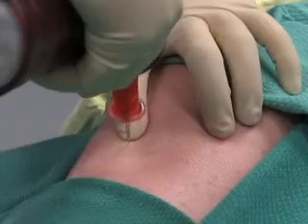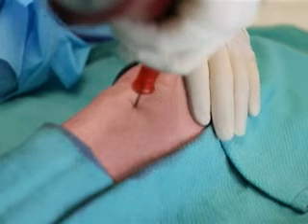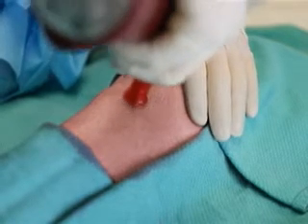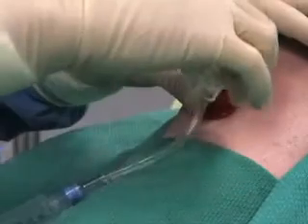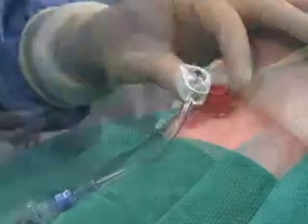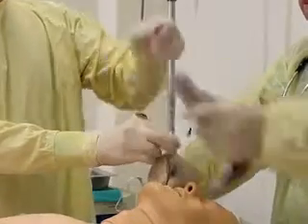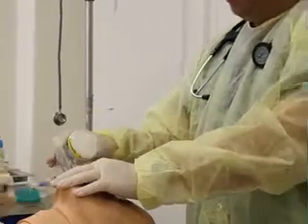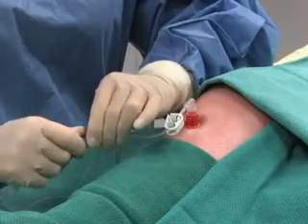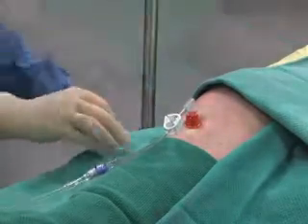Although the insertion of an intraosseous needle was originally performed in pediatric resuscitations, this method has gained acceptance for use in adults, especially since the advent of mechanical insertion devices. The most recent guidelines from the Advanced Cardiac Life Support Certification Institute, published in 2010, recommend the intraosseous route over the endotracheal route for the administration of fluids and medications in adult patients in whom intravascular access is not available.